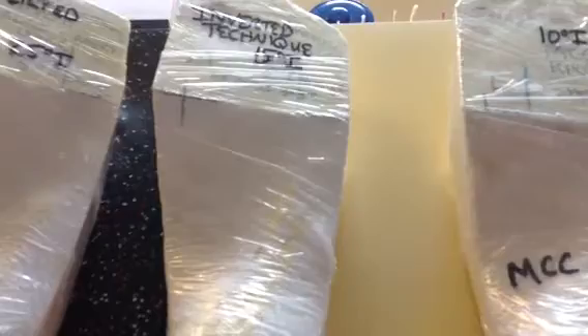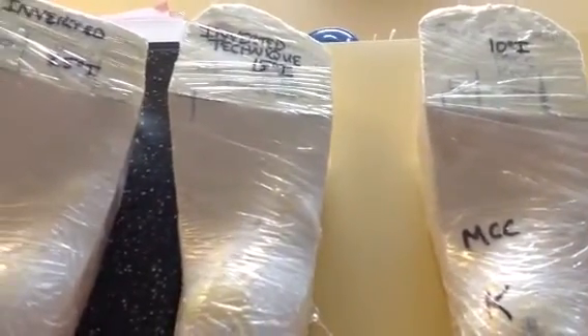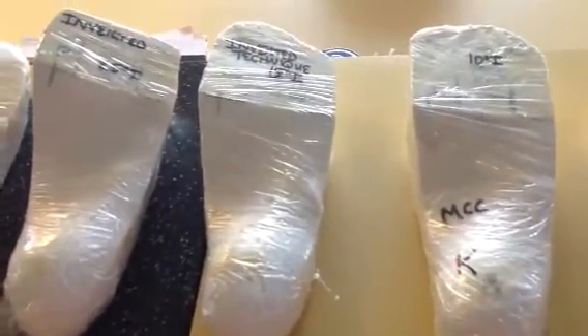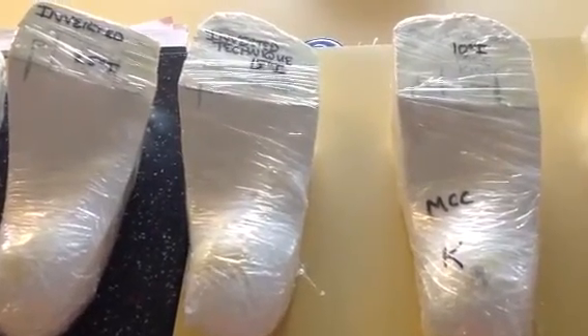Here's really the classic starting point of the inverted orthotic technique — a 15-degree pour, which gives you about three degrees of varus support.